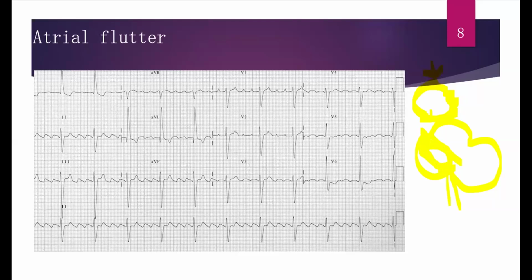So what happens in the ECG is you get these flutter waves. Flutter waves are sawtooth waves. These sawtooths can be predominantly up or predominantly down, depending on the clockwise or counterclockwise motion. You don't need to know that. But generally, this is atrial flutter, and it has this teeth-like, sawtooth appearance.